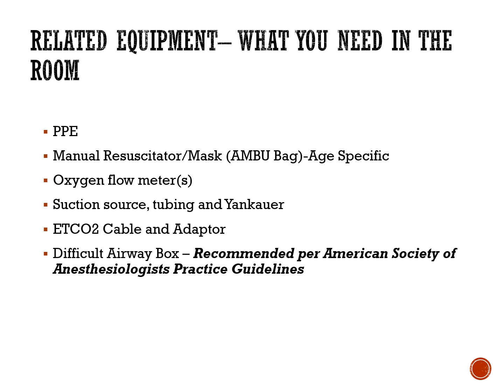Our protocol at our hospital is a minimum of an N95. A manual resuscitator bag. Ambu is a manufacturer, but Ambu or other, and that it's proper age specific. So if it's an adult patient that you're intubating, that you have an adult manual resuscitator bag. Oxygen flow meter or meters, because perhaps they're on a nasal cannula right now, or they're on a non-rebreather. You don't want to interrupt that, so you leave that on, and you would connect the manual resuscitator bag valve mask to that second flow meter.